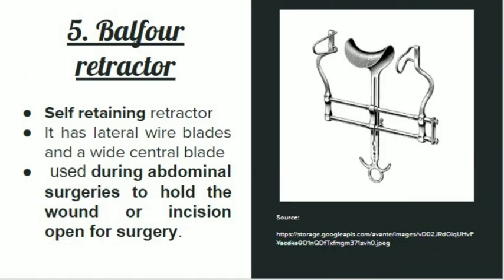The next retractor is the Balfour retractor. It is a self-retaining retractor — as you can see, it has a system of screws. It has lateral wire blades and a central wide plate that looks like a door retractor. It is used during abdominal surgeries to hold the wound open for surgery.